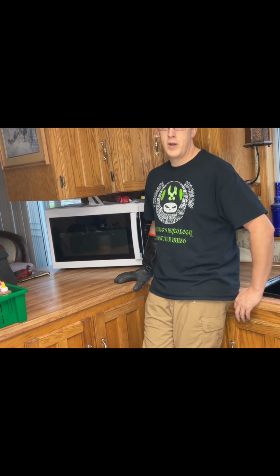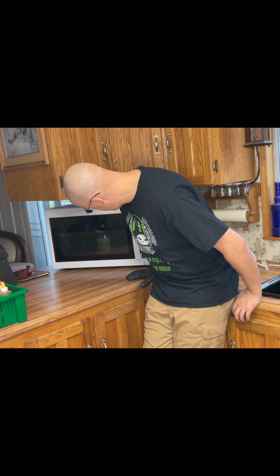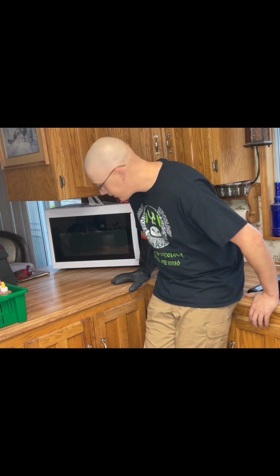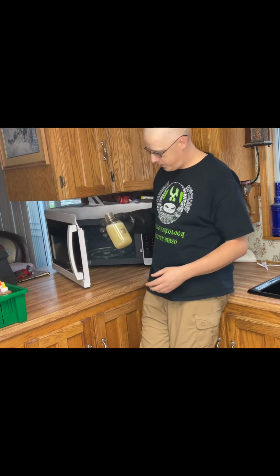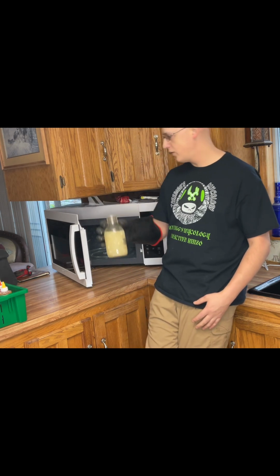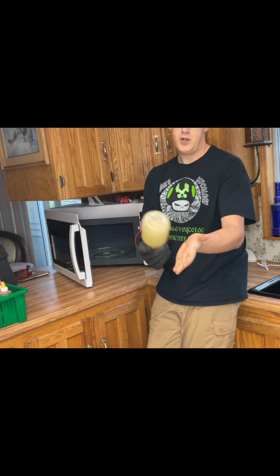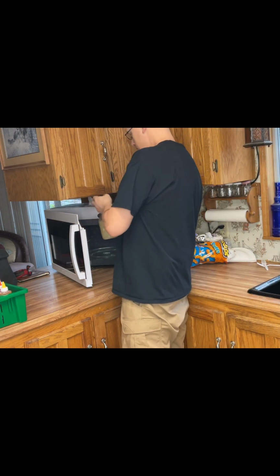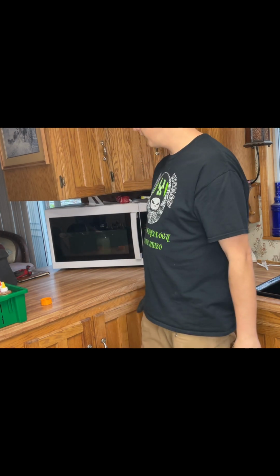Alright, so here we are playing with the Gellan gum in the microwave now, and we've run it through about 3 cycles at 1 minute. We're just watching it here through the glass to make sure that it doesn't boil over. The Gellan gum has to get pretty warm to melt in. It's not like the agar where it will turn into liquid early on. You can see it's kind of moving now, so it's not too bad. It's not that super duper soup we were seeing earlier, but we do still have chunkies sticking around on the wall there, so we're going to keep microwaving it until it almost boils over, and then we'll pull it off and throw it on the magnetic stir.